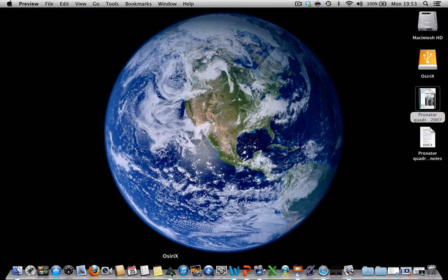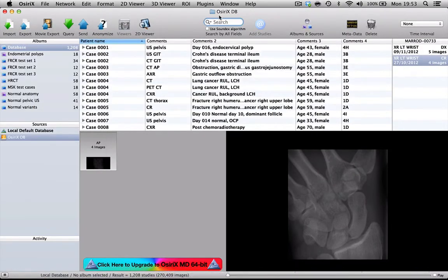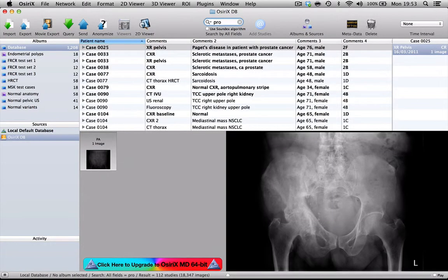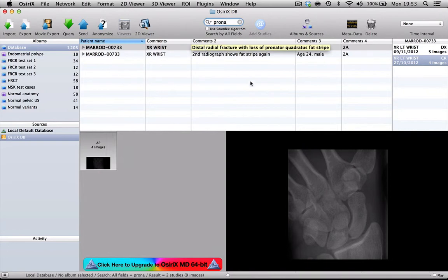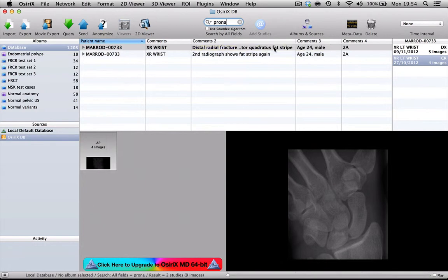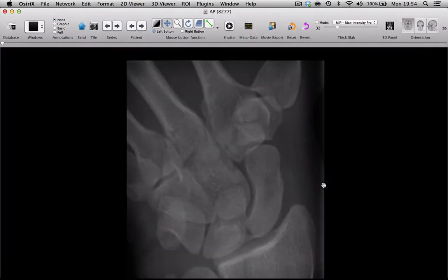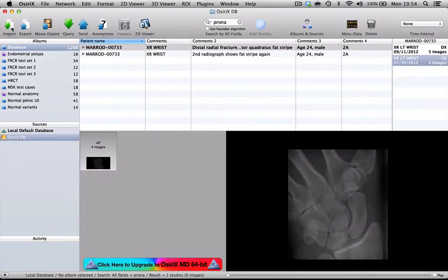So if I go back into OsiriX we'll just try and find that case now. So in the search column, I'm going to look here and there is the case. It's a 24-year-old male. We've got an initial radiograph here showing loss of the pronator quadratus fat stripe, which you can see quite nicely isn't there on the initial examination.